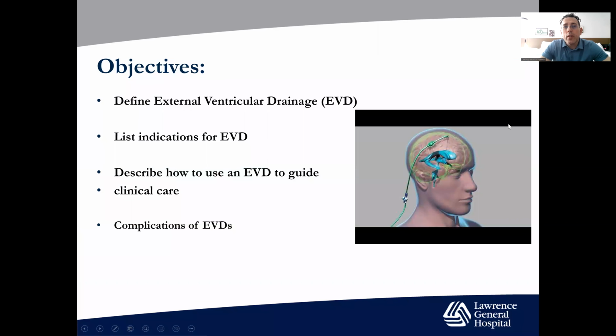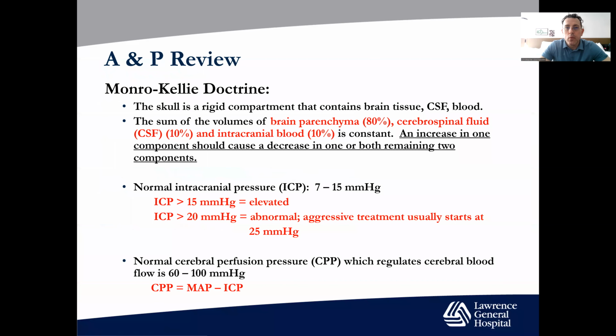So the objectives: we're going to define what an EVD is. We're going to list indications for EVDs. We're going to describe how to use an EVD to guide clinical care. We'll talk about complications from EVDs that you should be aware of.